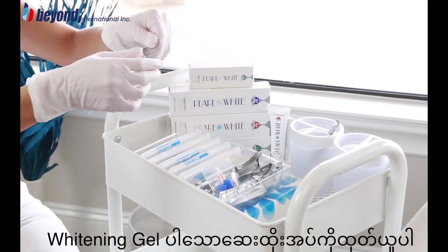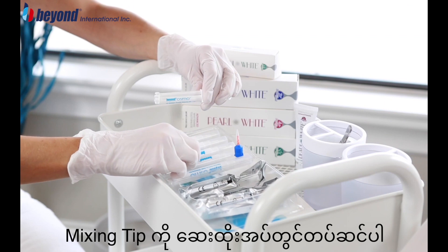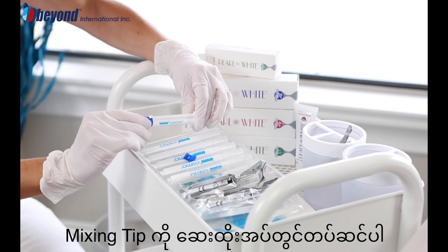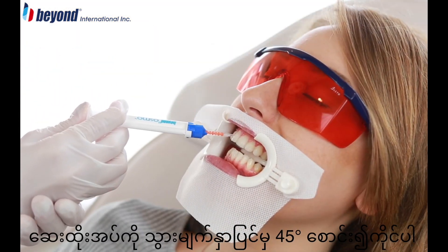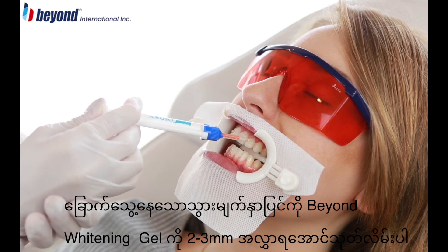Remove the whitening gel syringe and tip from the vacuum sealed foil wrapper. Attach the mixing tip to the dual barrel syringe of whitening gel. Holding the syringe at a 45 degree angle to the tooth surface, apply a 2 to 3 millimeter layer of the Beyond whitening gel to the dry surface of the teeth.